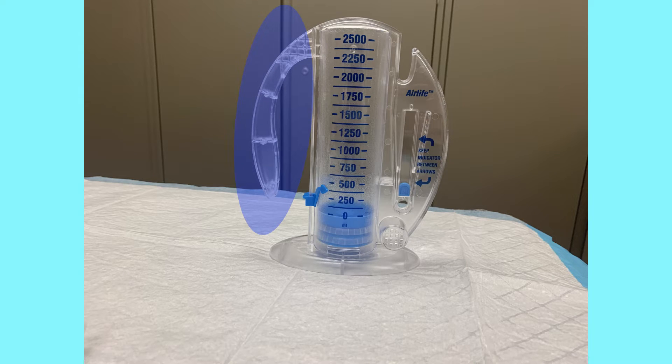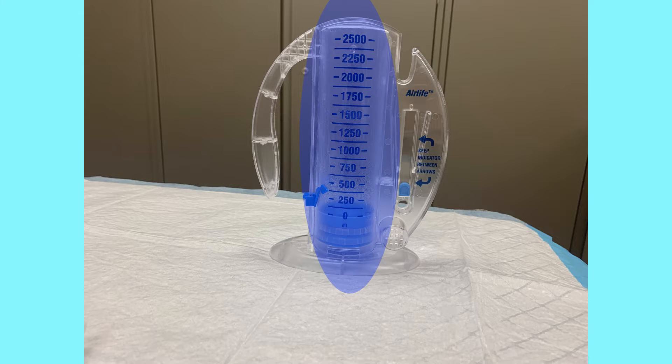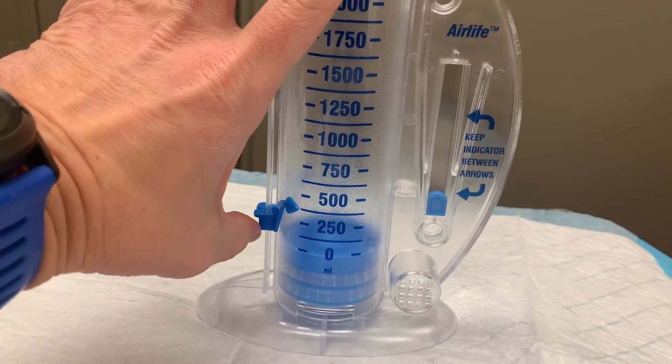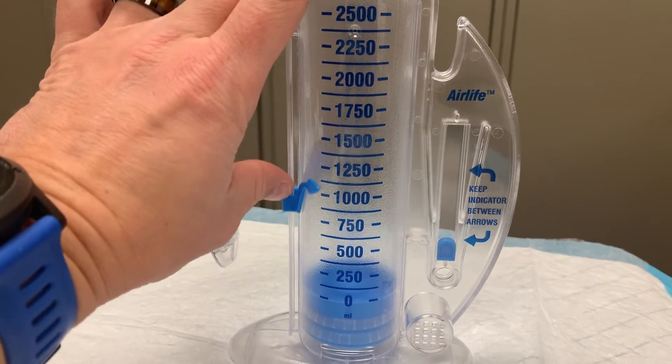The left side of the device is a handle to allow the patient to hold the spirometer in front of them while breathing. The cylinder in the middle of the device is how the patient will measure the volume of their breath. The markings indicate how many milliliters of air they have inhaled into their lungs. There is a sliding marker attached to the cylinder that can be moved into position to designate a goal volume or to mark the patient's best performance.